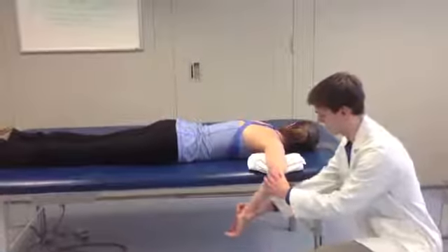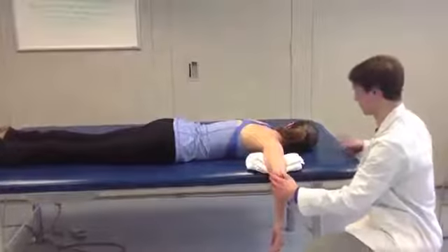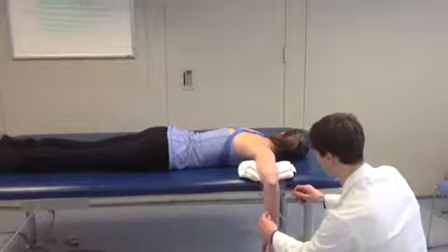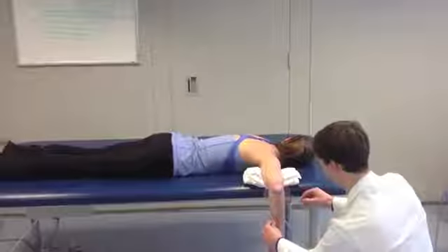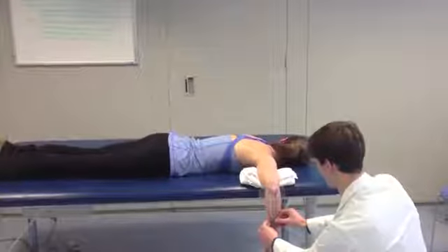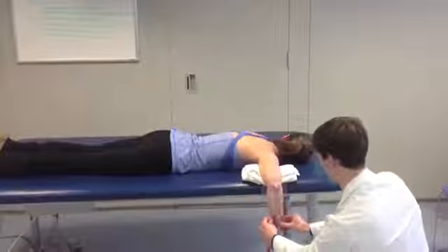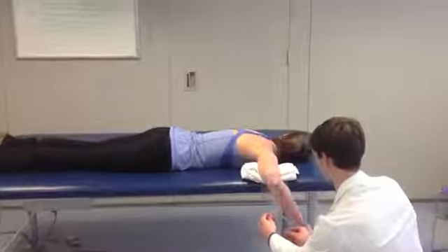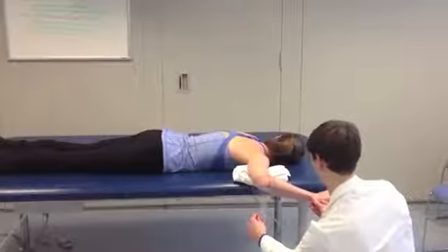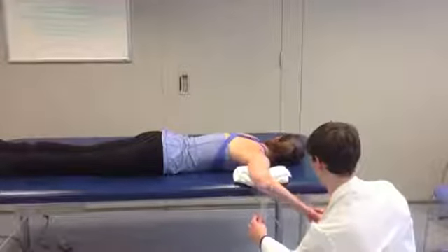You want to line up the goniometer with the olecranon process, the stationary arm perpendicular to the floor, and the movable arm with the ulnar styloid process. Measure active range of motion, and then measure passive range of motion.